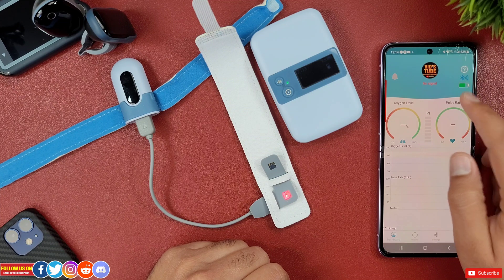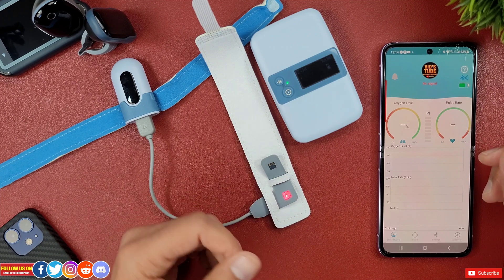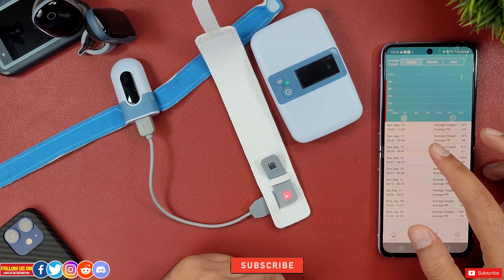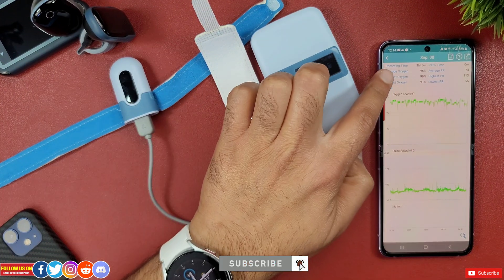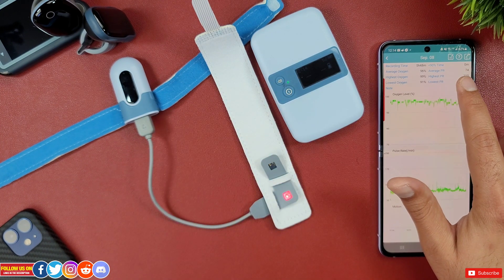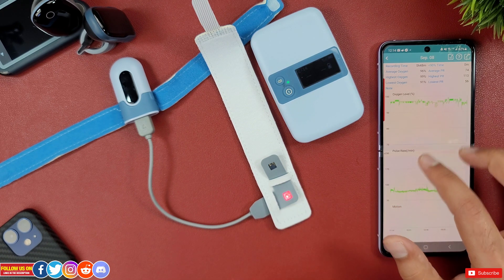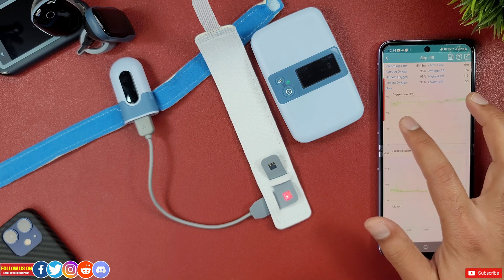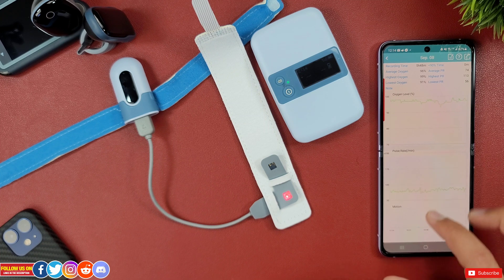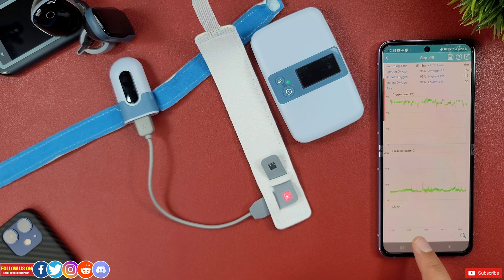You can also change the profile picture to your child's photo. On the bottom panel, you can access history. Looking at a test night, the reading shows recording time, average oxygen level, highest and lowest levels, the percentage of time below 90%, average pulse rate with highest and lowest. You can access graphs for both oxygen and pulse rate, and pinch-zoom to go to a desired spot. At the very bottom there is motion data showing how many times and at what times your child moved.